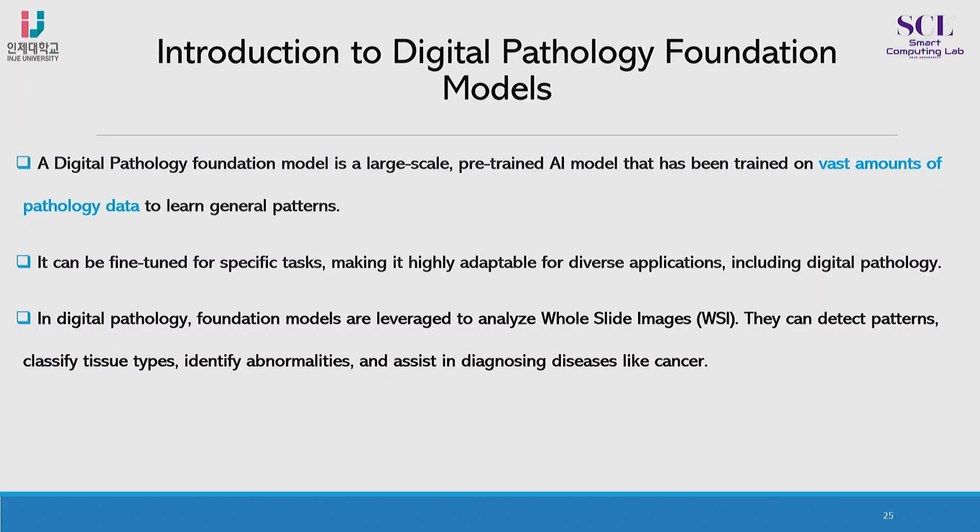Previously, people used transfer learning techniques. For example, if we use ResNet or VGG, those transfer learning techniques are based on ImageNet. ImageNet consists of natural images, and if we use those transfer learnings for extracting the features, although they give good results, because they are trained on natural images, they don't give high quality performance.